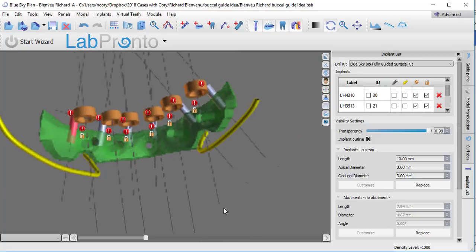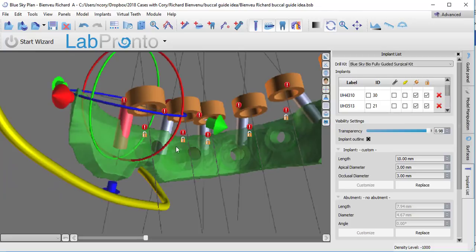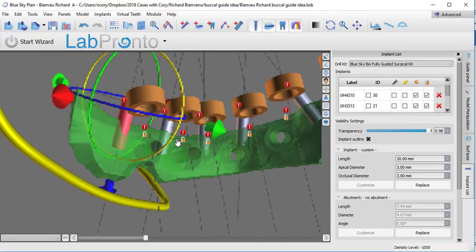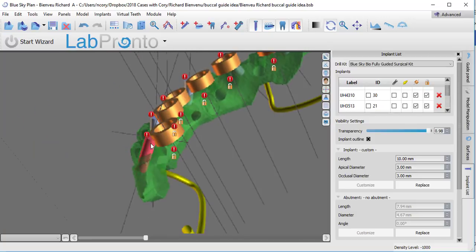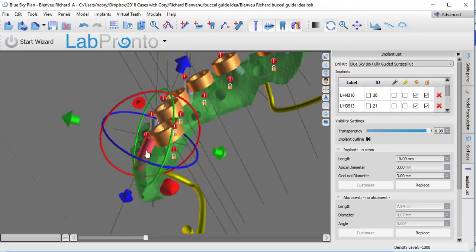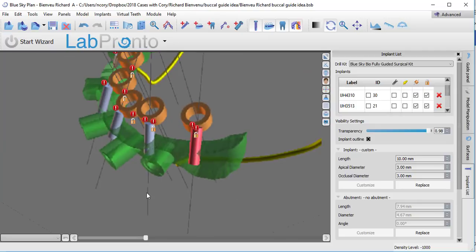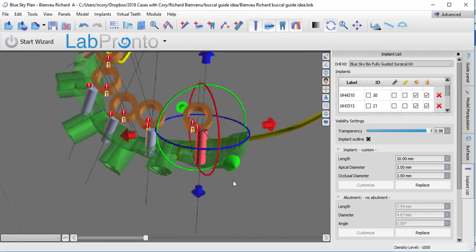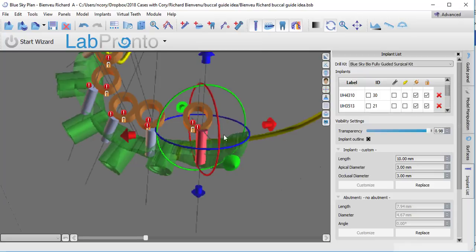You do want to be careful that you're not impinging onto the internal of this. As you can see right here, that one is going to be problematic because it's going to interfere with the bone reduction. It's not going to be able to index properly. So we just take that one and scoot it back a little bit. Just be aware that that can be an issue that you need to address. Once again, if you need to, print it and then just grind that back a little bit. And then just for stability's sake, one other thing I would do is connect each implant tube together. So let's duplicate again.